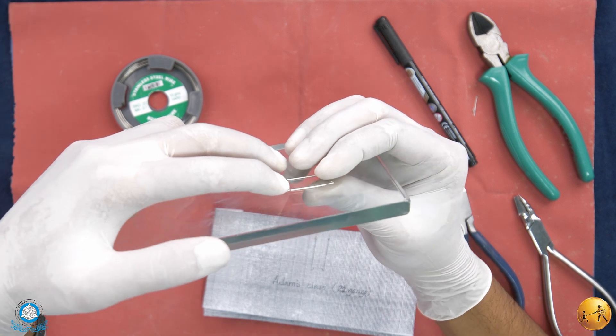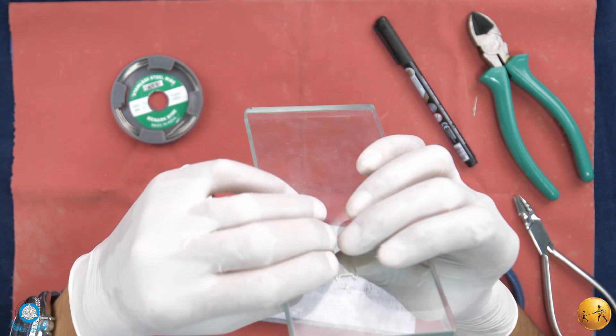Now all the points on the wire are touching the glass slab uniformly.